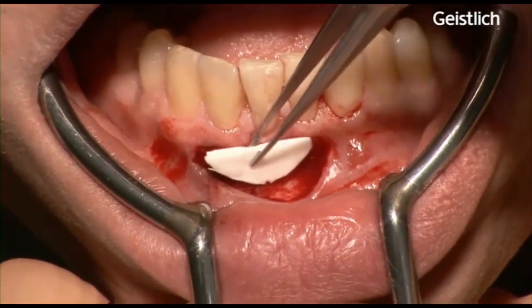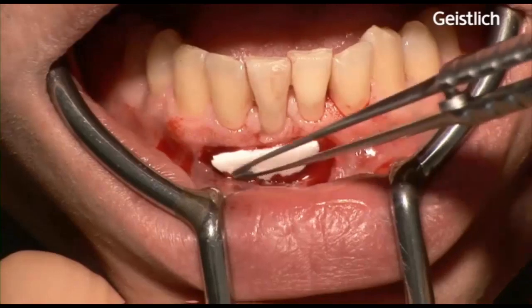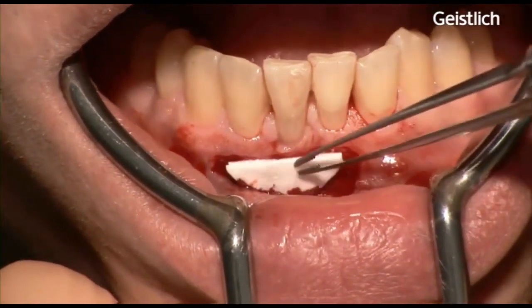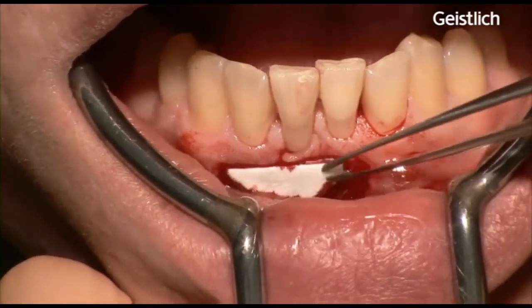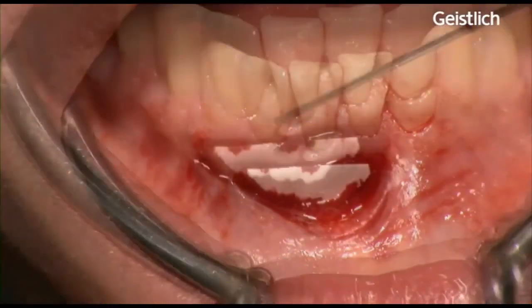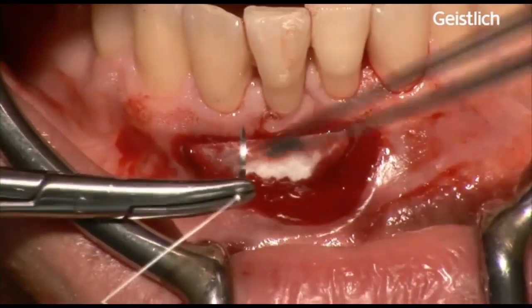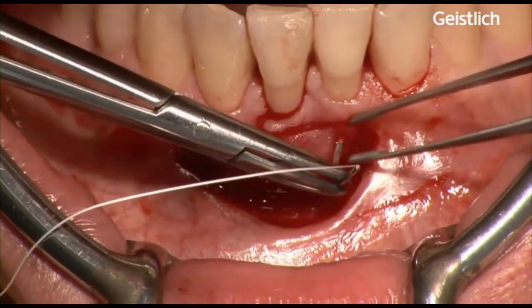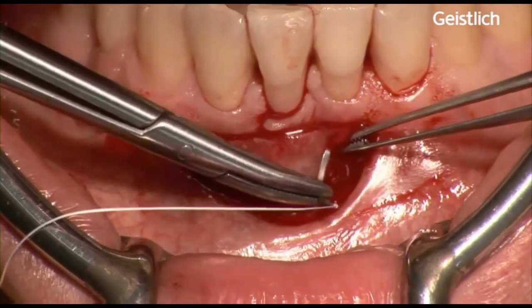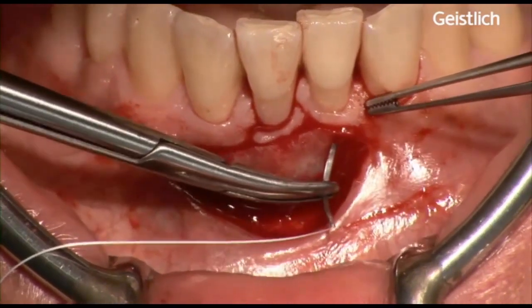Mucograft is placed on the prepared periostal bed with a smooth surface facing the oral cavity and the porous surface facing bone and periosteum. The matrix is fixed to the small coronal band of keratinized tissue and to the periosteum, and if necessary to the surrounding soft tissues with non-resorbable, non-irritating 6-0 interrupted sutures.